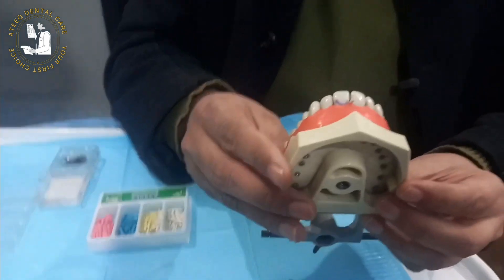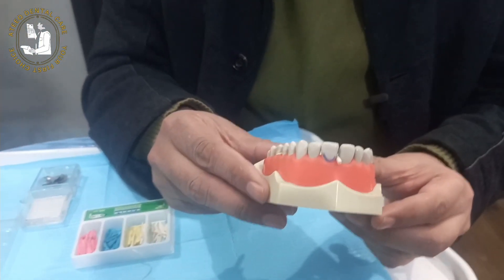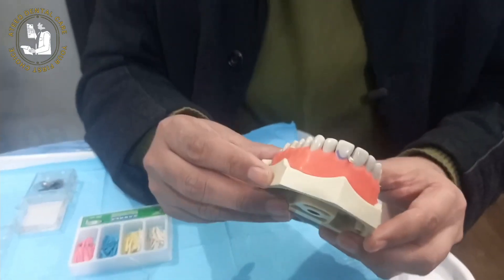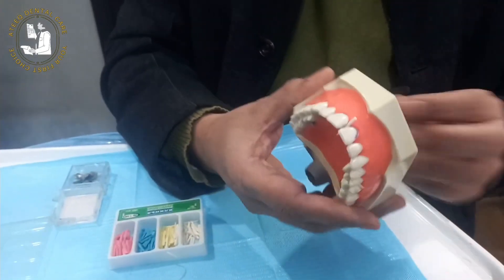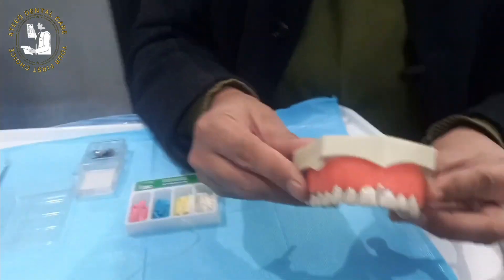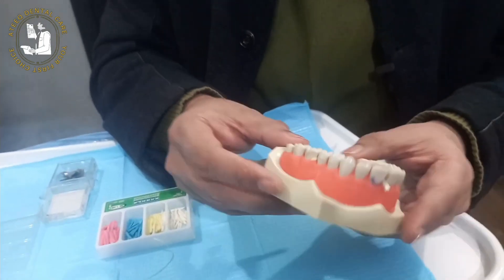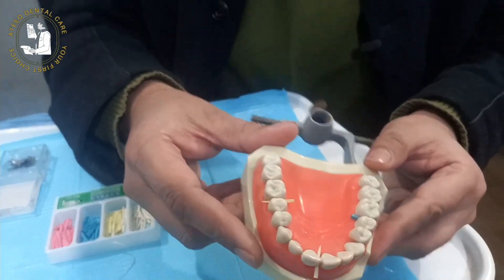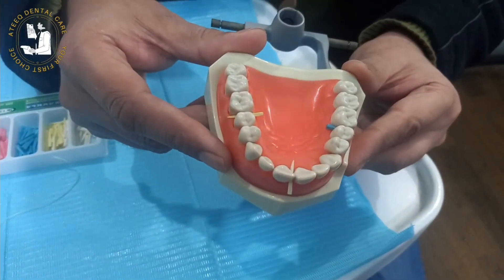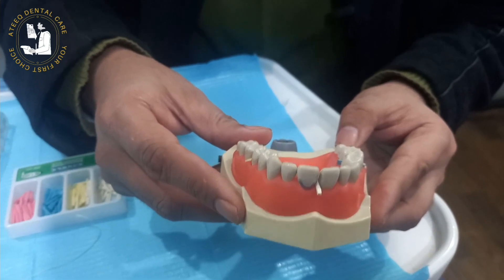For pre-wedging, we apply wooden wedges in different parts of the teeth — in the anterior zone between the incisors, and in the posterior zone between the premolar and molar region. Wooden wedges, also called interdental wedges, are basically used to separate the teeth.